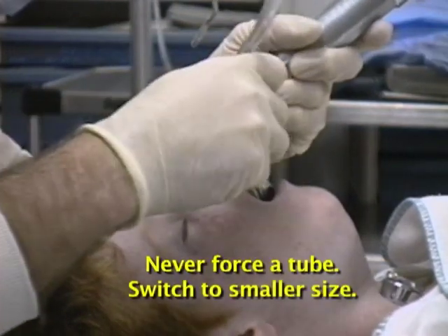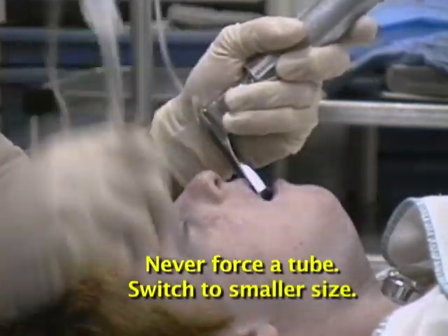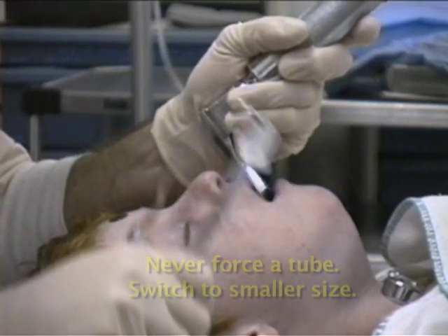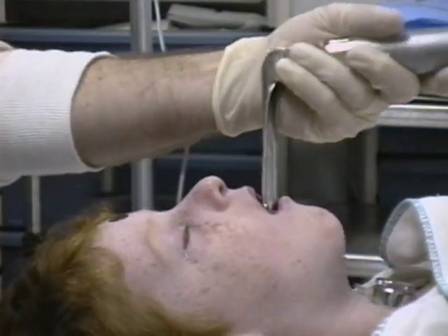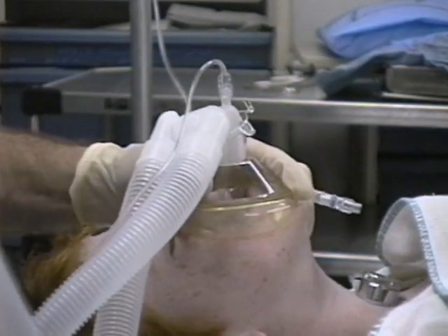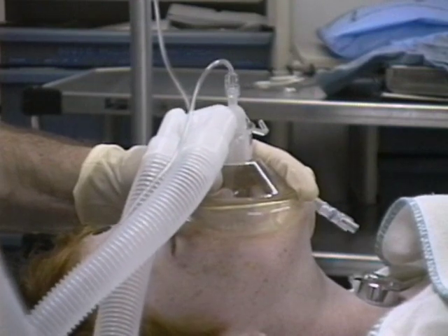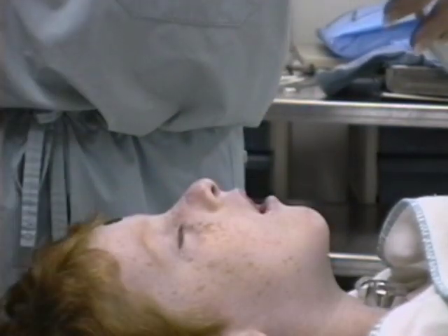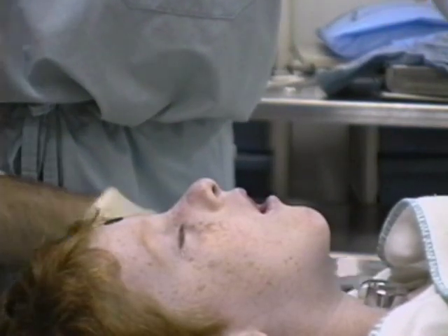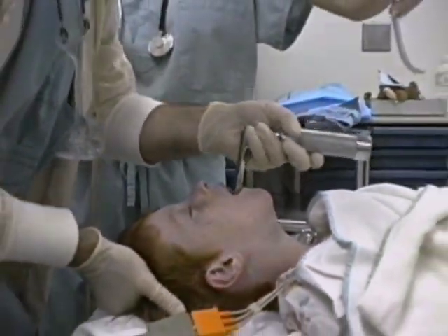Change to a smaller size if the tube won't pass easily. Forcing a tube can cause traumatic swelling. Children can't hold their breaths as long as an adult before the onset of hypoxia. If you have trouble intubating, stop and ventilate before trying again. During awake intubations, let the patient rest and breathe oxygen. Lack of ventilation hurts patients, not the lack of an endotracheal tube.